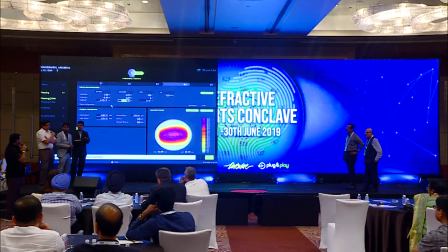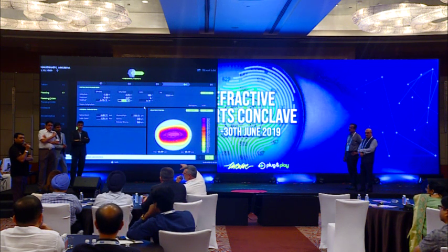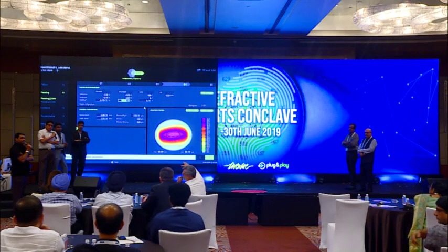So I do agree with John Kanellopoulos, but John is also looking at, hey, wait a minute, this is 3.4 diopters. What is my posterior? And here the posterior can play a role. So he would go half a diopter less. Exactly. Maybe I would even think of keeping it at 3 diopters of astigmatism. So with the rule, if you keep a little bit, a quarter or a half, if you don't flip his axis, he's not going to be extremely unhappy.